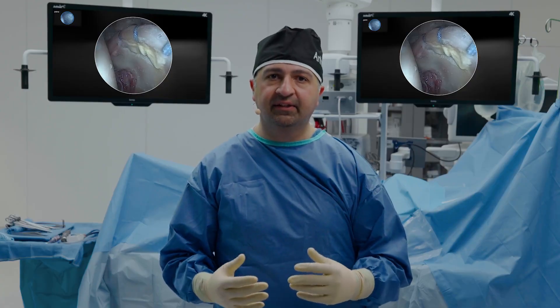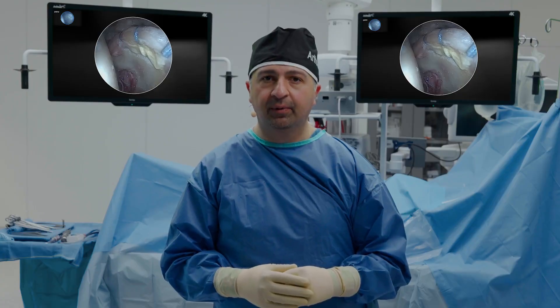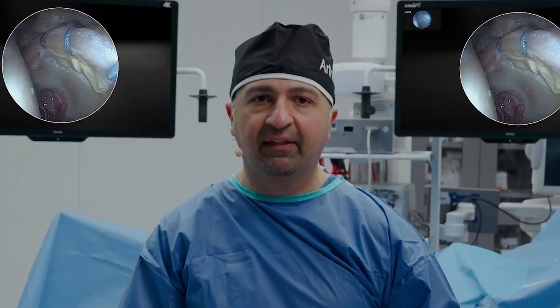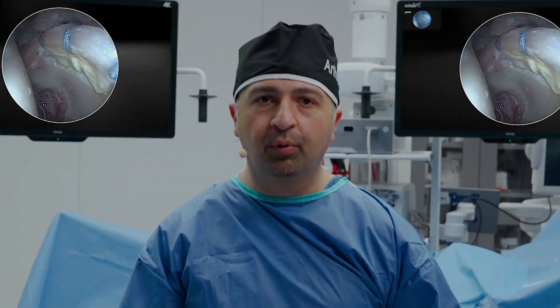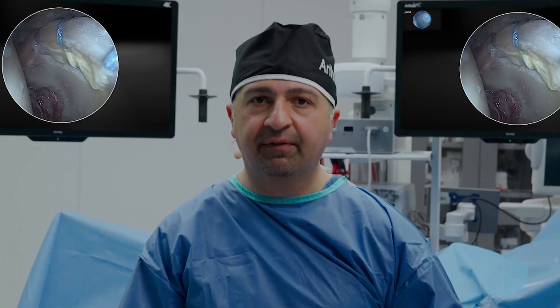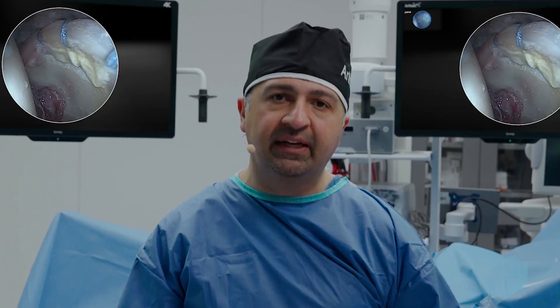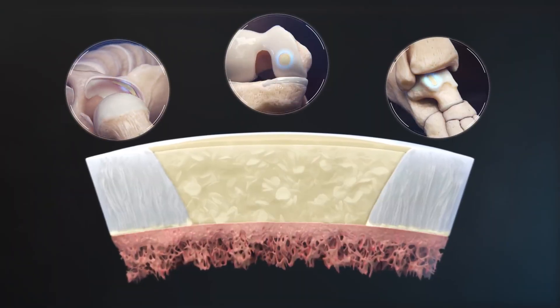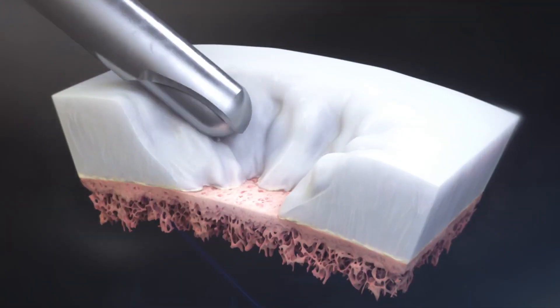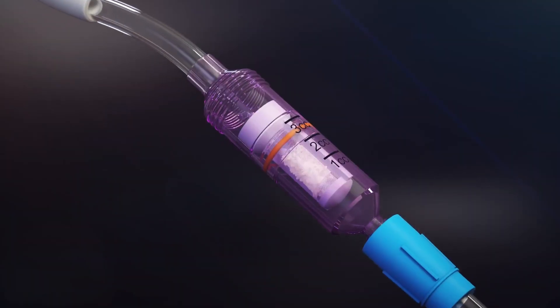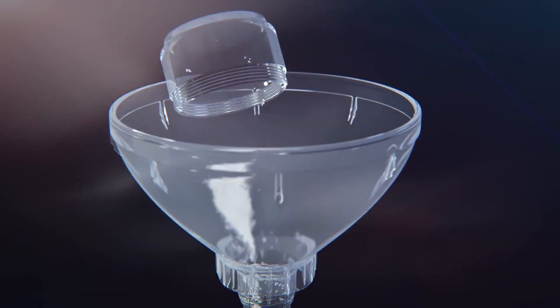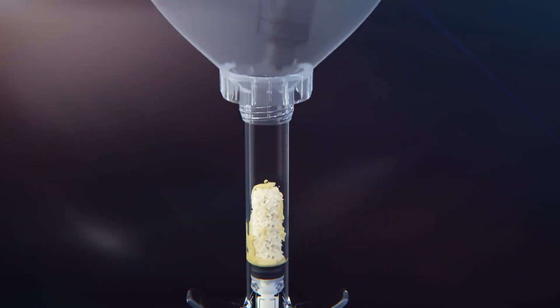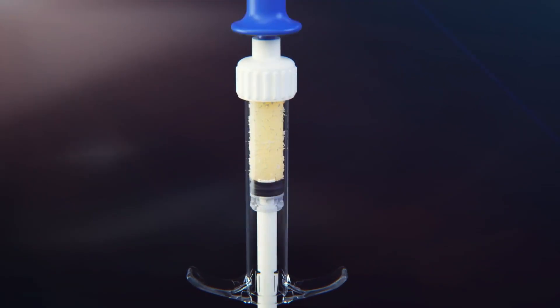These are cartilage defects that we encounter not infrequently in the setting of hip impingement surgery. These procedures have been challenging given that these are often poorly shouldered lesions that are difficult to fill and can often lead to progressive degenerative disease in the hip. AutoCart has given us the advantage of a single stage procedure using the patient's own viable chondrocytes combined with biocartilage and ACP to reliably fill these lesions and treat them in a single setting.